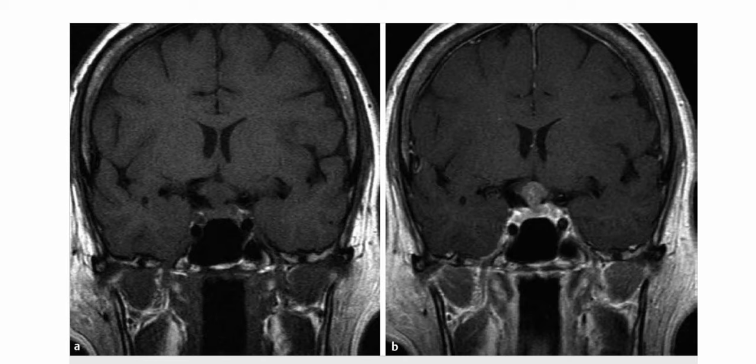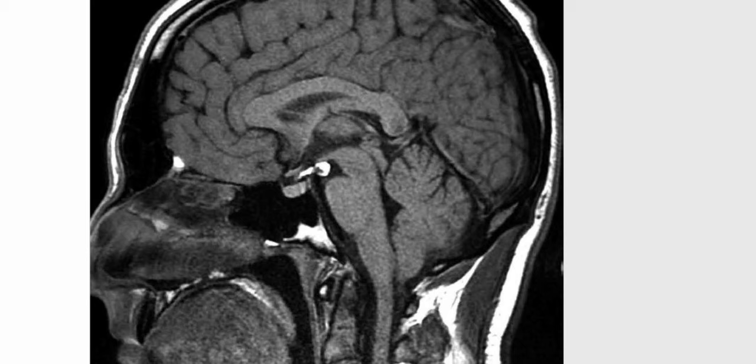This is a case of a 14-year-old boy presenting with migraine and headaches. The sagittal T1-weighted MRI shows a lobulated hyperintense mass within the interpeduncular cistern, extending into the posterior aspect of the suprasellar cistern.